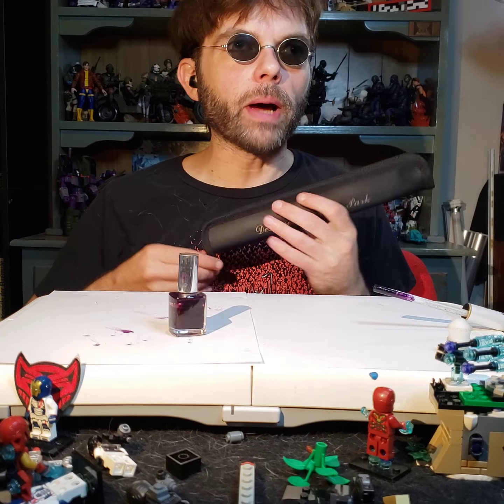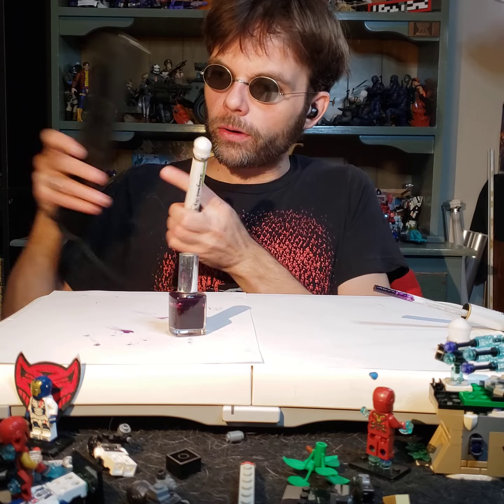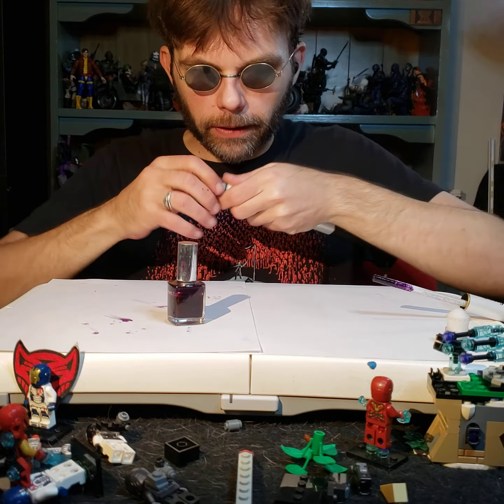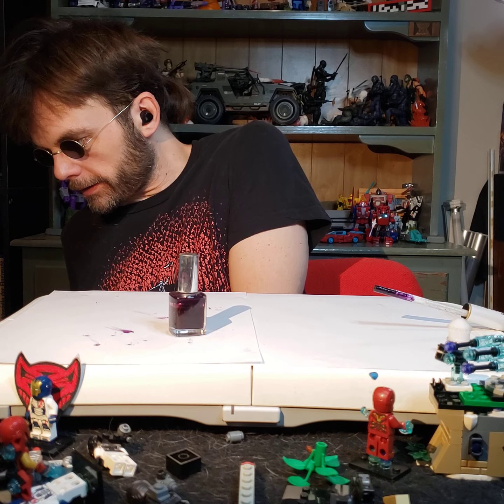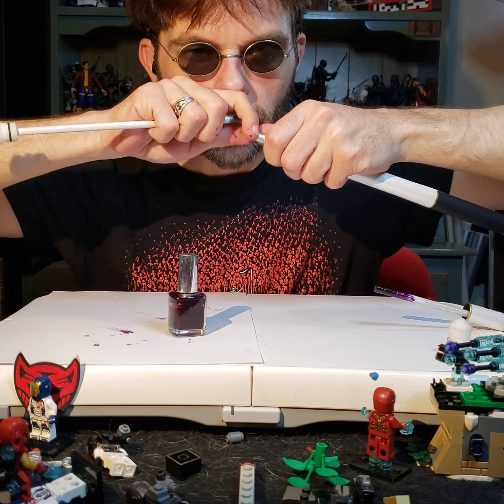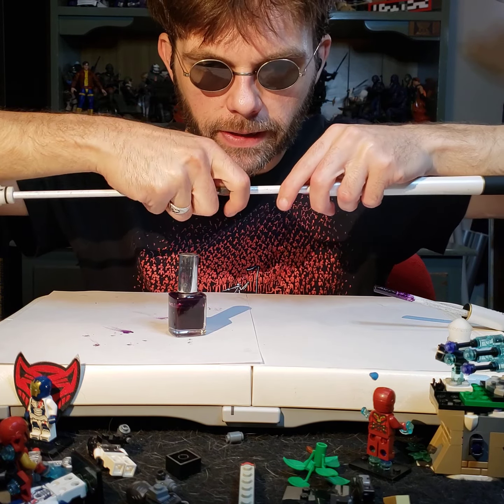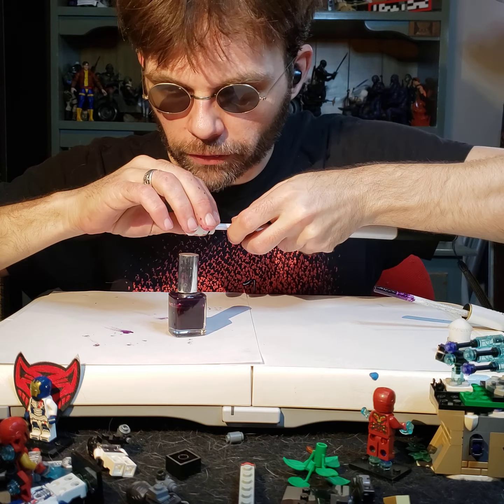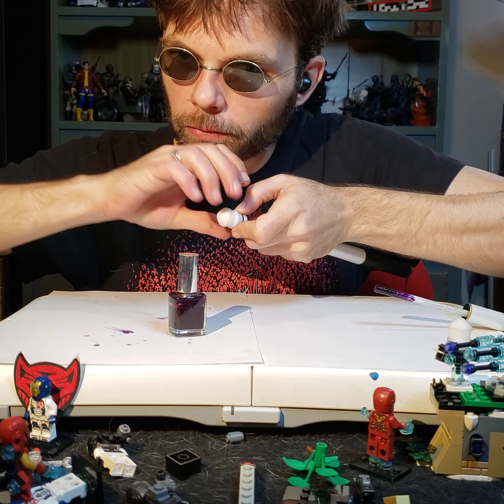Because both of my Chris Park Designs canes are having the same issue. So, pulling out the second one, my newer one, and it's got a piece of leaf stuck in it from when I just walked today. This is actually the one that fell off in the road. It pulls out too. We don't want it to pull out. I know, that's a terrible double entendre sometimes. So we're going to find the end that we need to find. There it is. All right.